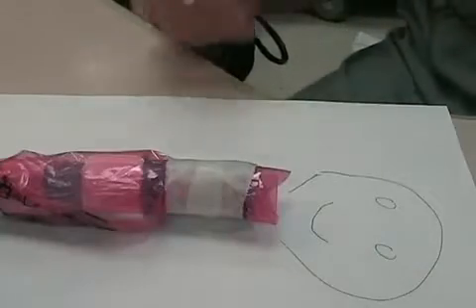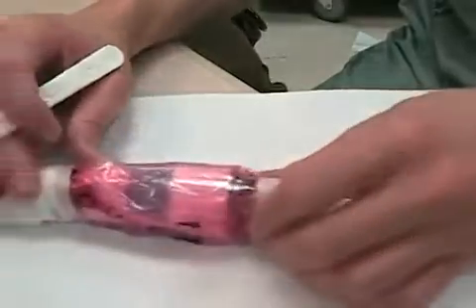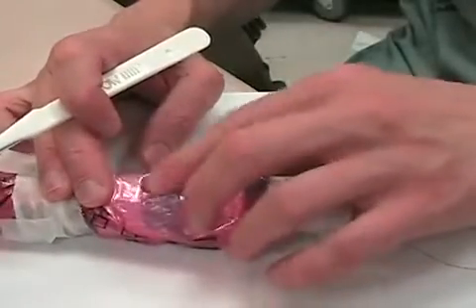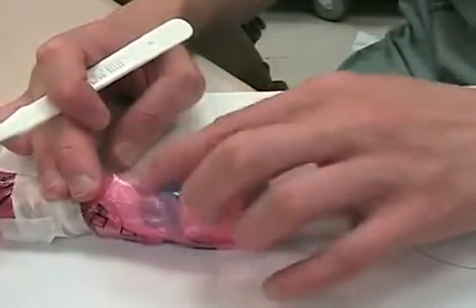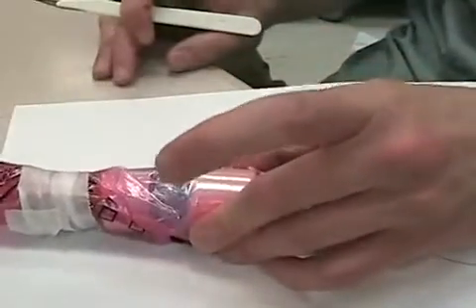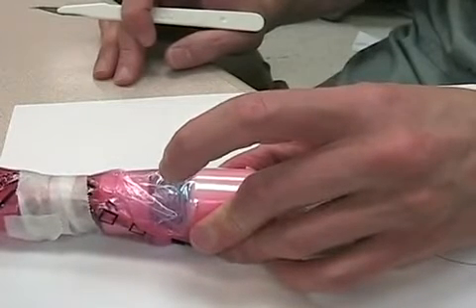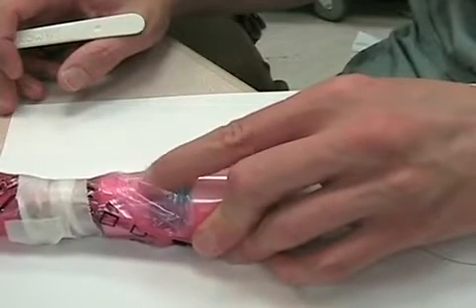Step one: find your cricoid — it's the little one down here. Thyroid is the big one. We're using clear skin for didactic purposes, but otherwise it's all by feel. This is your Adam's apple up here, cricoid cartilage down here, and the cricothyroid membrane in between them. With your non-dominant hand, grip the thyroid between your middle finger and thumb — get a nice tight grip and don't let go no matter what. With your index finger, palpate the cricothyroid membrane through the skin.